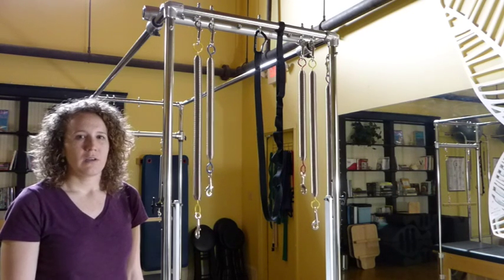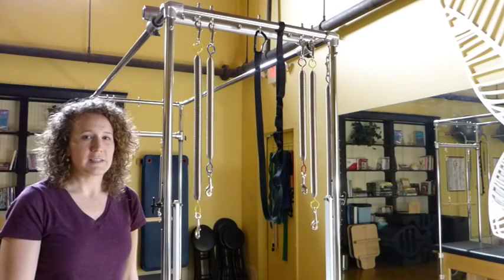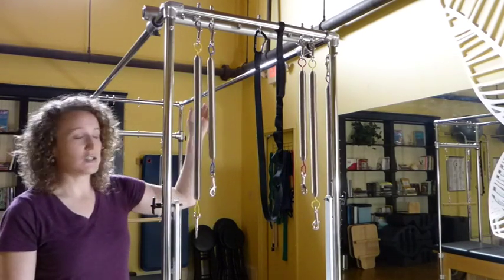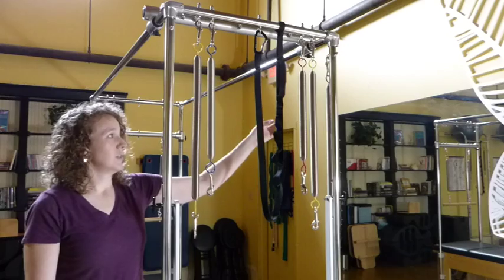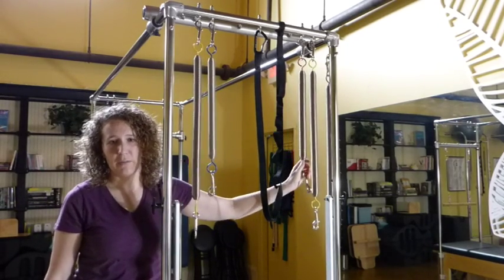To check the spring for anything odd that you can't see with your naked eye, just run your hand gently down the body of the spring. It should feel nice and straight and uniform. If you encounter a spring with a kink or with a little S-curve, then you'll be able to feel it right away by running your hand down the body of the spring.